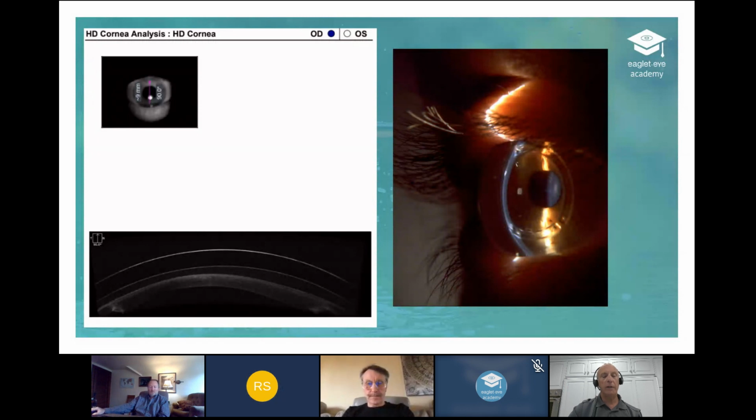And this works in the lenses. We talked earlier about the lens neutrality. This happened to be a Zen lens. We all have our favorites. I find it just as accurate with the other lenses. In my case, I'm using a lot of Boston Sight and some of the Synergized VS and the One Fits. And the algorithms are very accurate. We fine-tuned those over the years, and they just work well across the board.